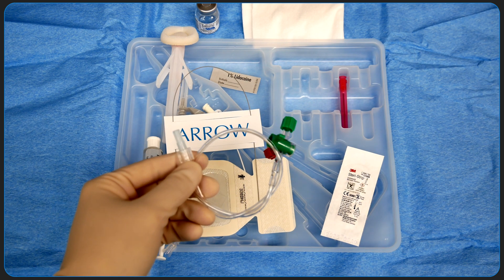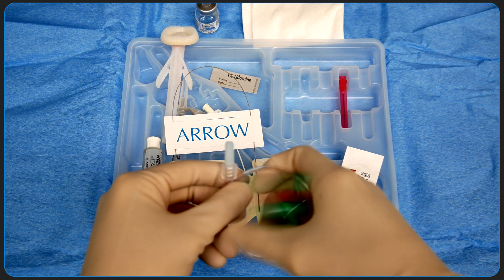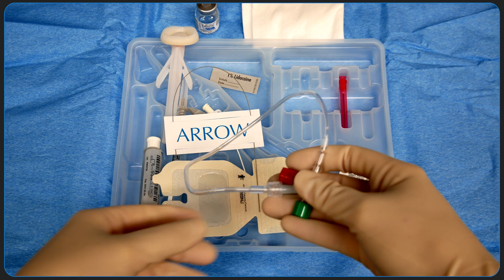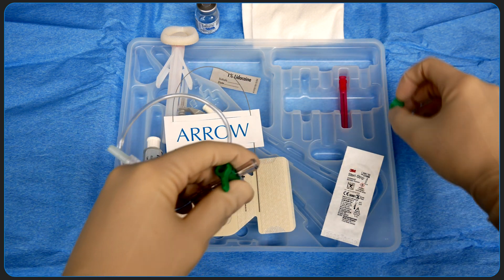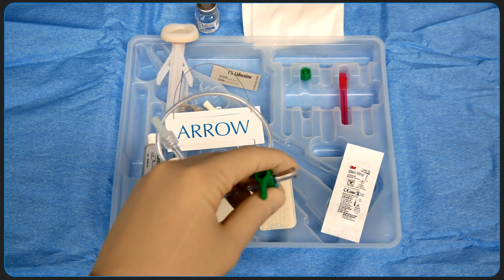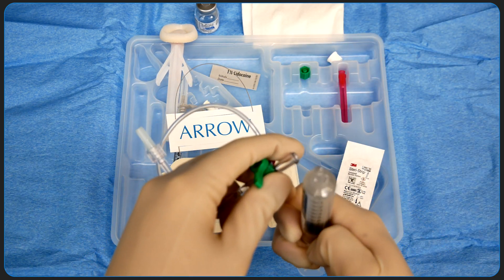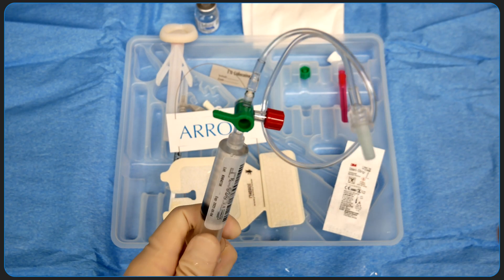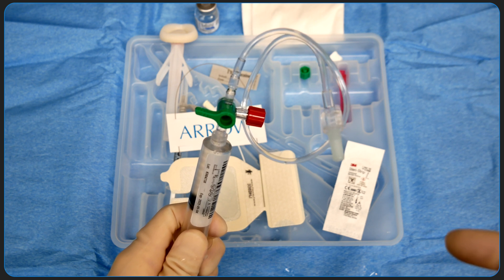Once we've cannulated the actual artery, this is the tubing that we use to connect the catheter within the artery to the arterial line transducer. The tubing itself is stiff and non-compliant, which is critical to transmitting arterial pressure waves. We're going to prime this tubing using the sterile saline syringe, flush out all the air, and then turn the stopcock off towards the patient.